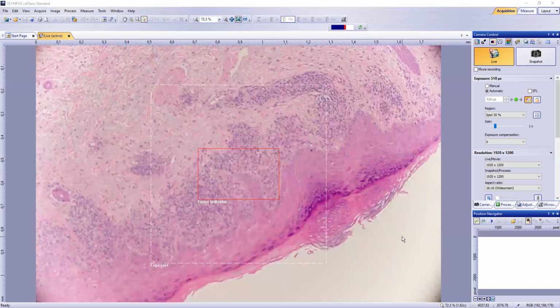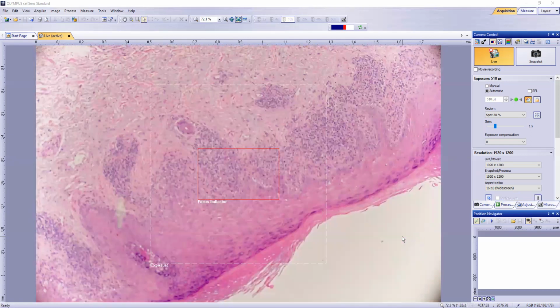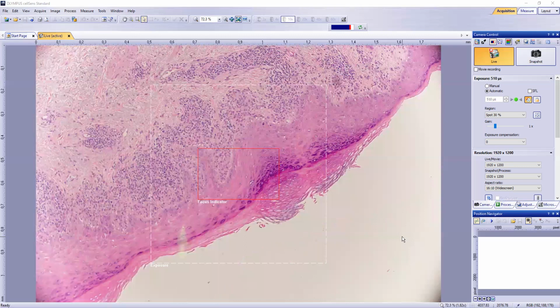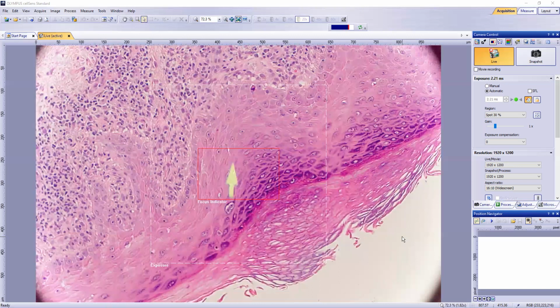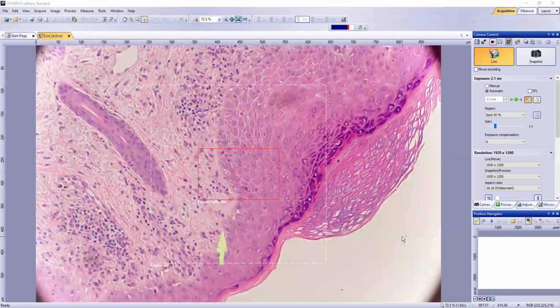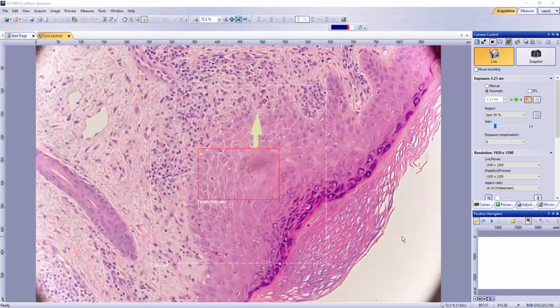In this example, there are other features that are specific for this diagnostic entity, Lichen planus, but I just want to highlight the presence of this lichenoid infiltrate in concert with vacuolar degeneration of the basilar epidermis as key features, coupled with, on closer examination, apoptotic keratinocytes, as you'll see here. And as we look across the basilar epidermis, we see more examples of those apoptotic keratinocytes associated with this lymphocytic infiltrate and some degree of melanin incontinence as well along the dermal epidermal junction.